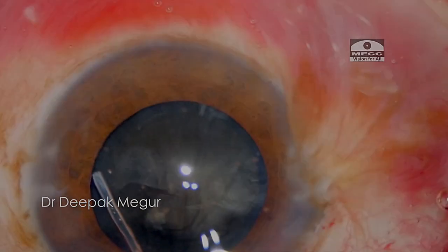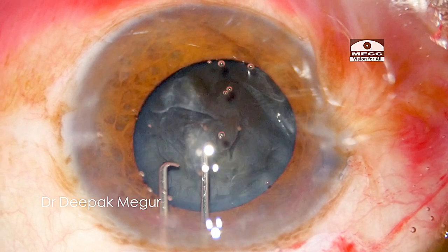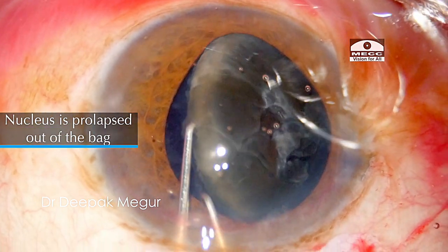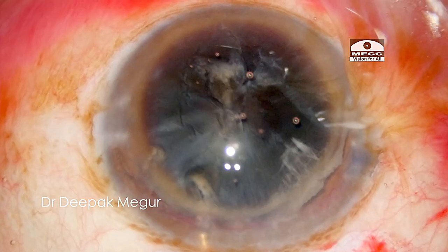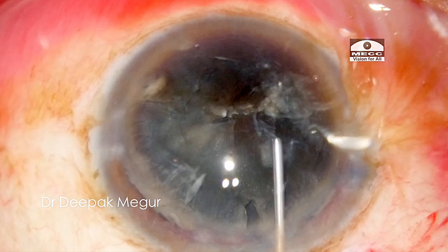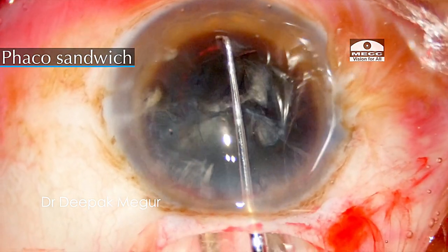Let us look at a few more cases. Here is a decently large rhexis. Hydrodissection is done, and then the nucleus is bimanually wheeled out of the bag into the anterior chamber. The OVD is replenished in front and behind the nucleus, and the nucleus is sandwiched between the vectus and the dialer and then extracted out.